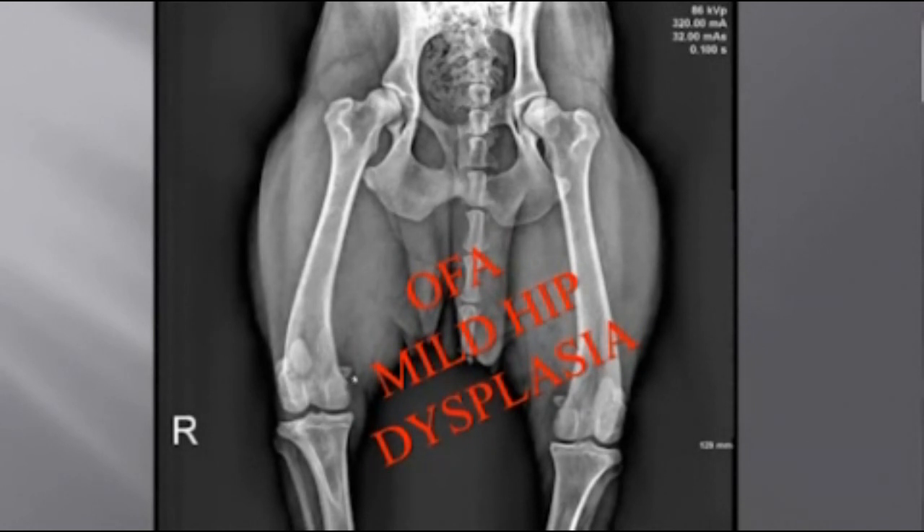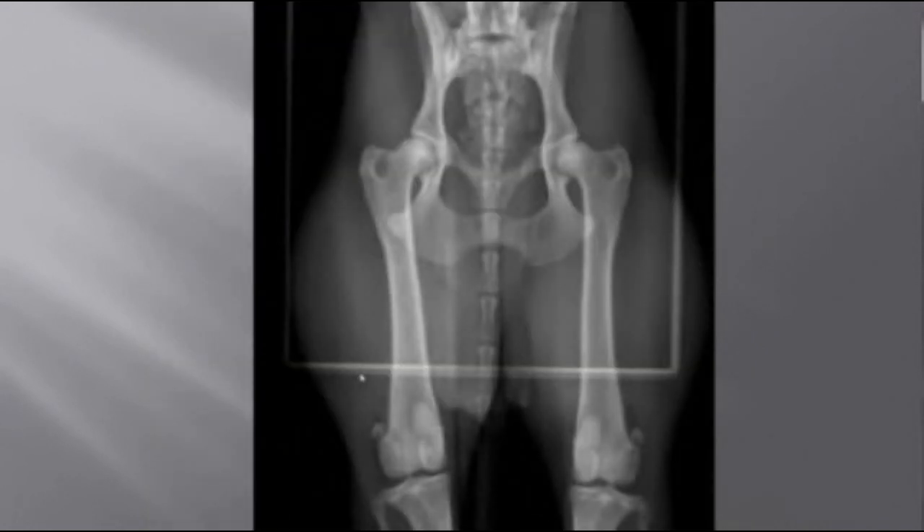Now let's look at another dog that did better. The femurs are close to being parallel — not perfect, but close. The kneecaps are close to being in the middle, a little bit to the inside, but fine. The obturator foramen are very close to being the same size, so the pelvis is flat. With the femurs almost parallel, the kneecaps near the middle, and the pelvis flat, this is a nice x-ray. This dog got an OFA good.